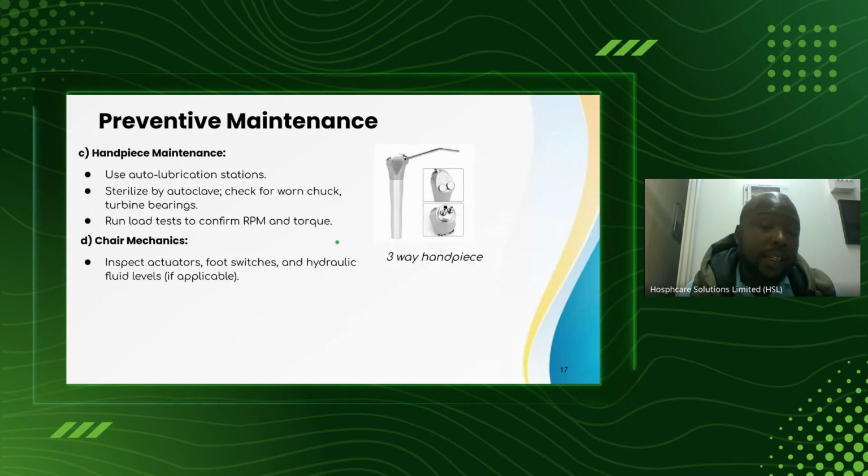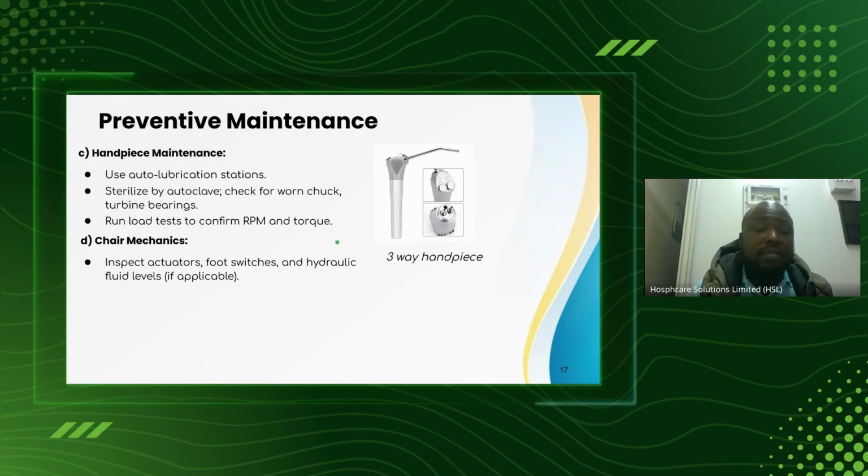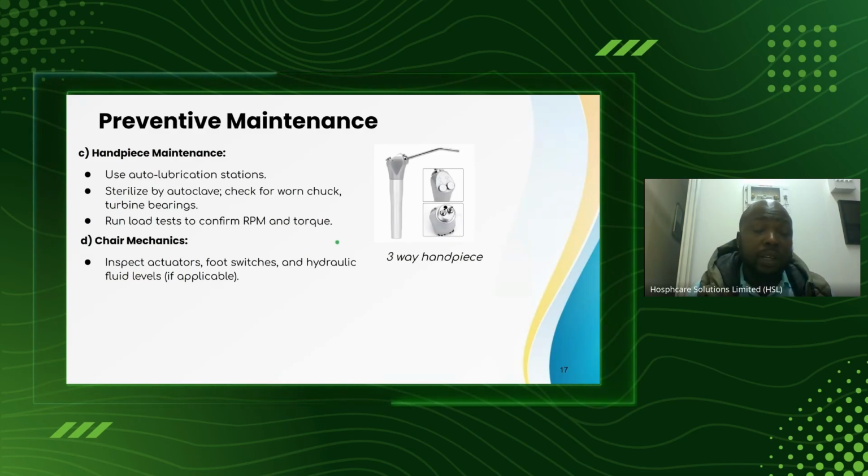So, the chair mechanics. Most of the modern units are using a telescopic motor to create the mechanical movement. These motors are very simple to maintain. You just need to keep them free of dust.